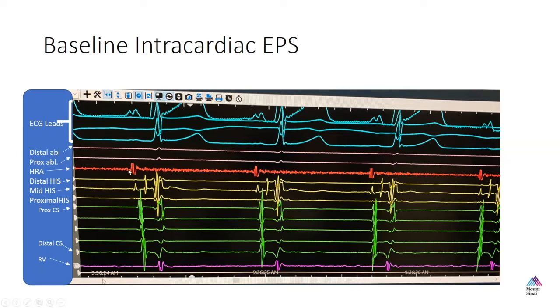So we have a catheter in the high RA. And again, this is in sinus rhythm. You can see the P wave is a little strange looking, but it's the patient's sinus P wave, and it's simultaneous with the atrial electrogram. You notice that the P wave actually is starting before the atrial electrogram, and that suggests that the high RA catheter isn't that high. It's not exactly near the sinus node, because if it were very high, you would think that it would be pretty much on time with the onset of the P wave. So this is probably not exactly a high right atrial catheter.